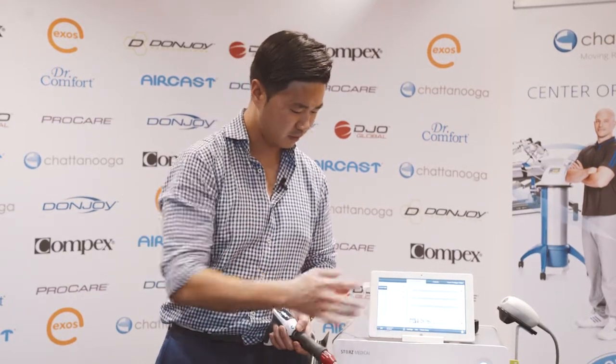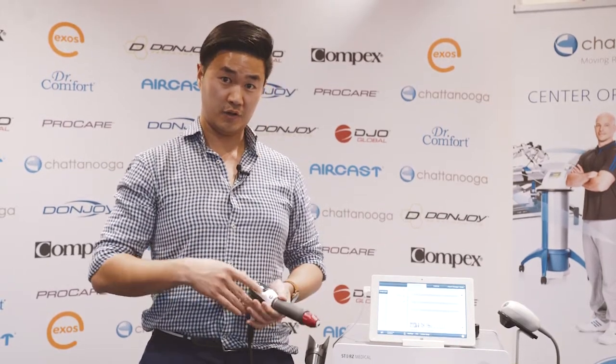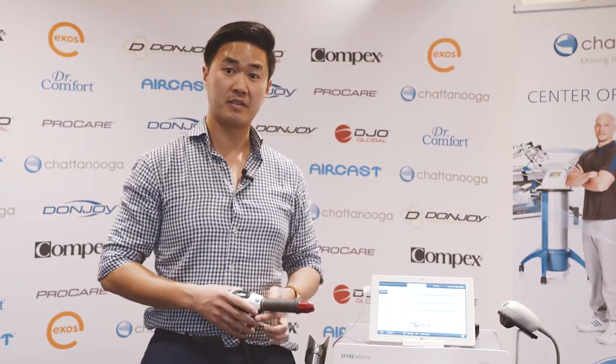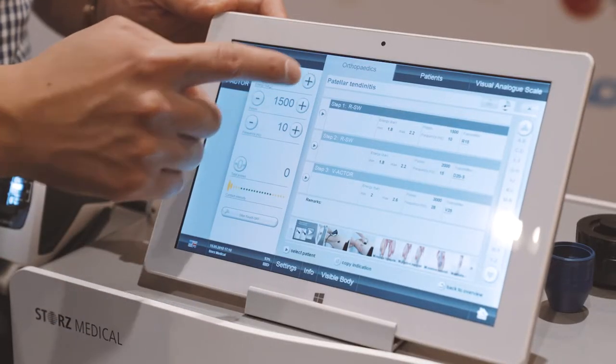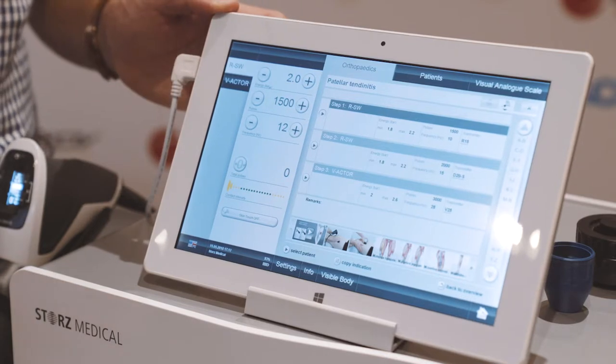The lowest I've gone down to is about 8 hertz. After doing this for a few sessions — normally doing no less than 2000 hits each time — I would progress to about 2.0 bars at 12 to 15 hertz, somewhere in that range.